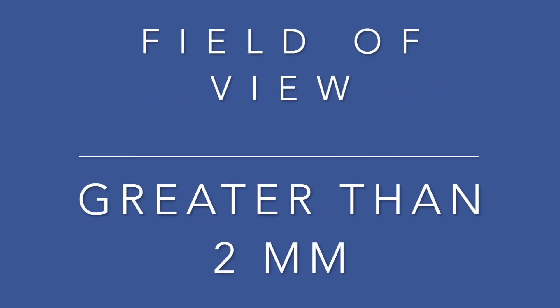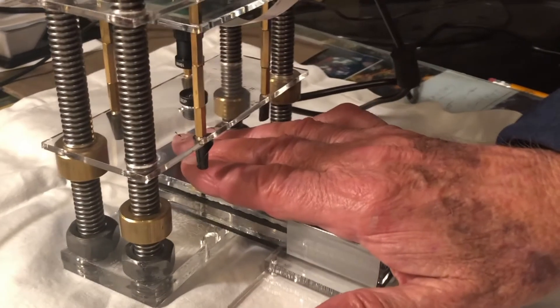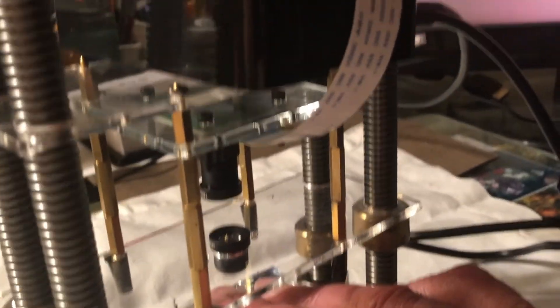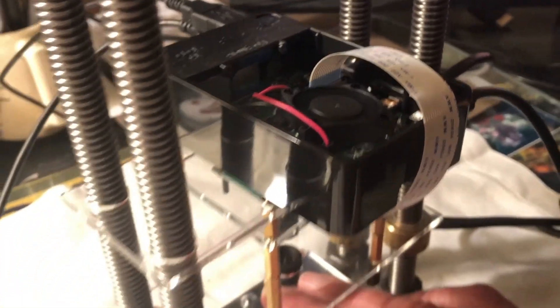A field of view of greater than 2 millimeters, and an algorithm to identify parasites. We incorporate blue light, which creates a contrast between red blood cells and microfilariae. This video of human capillaries proves the technical capability of the Onchoscope.